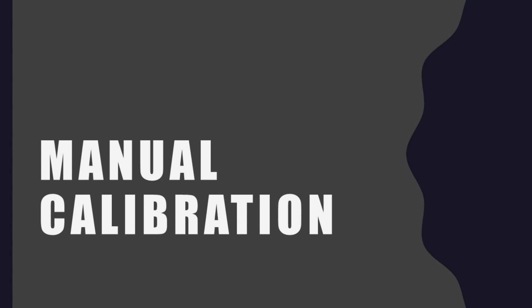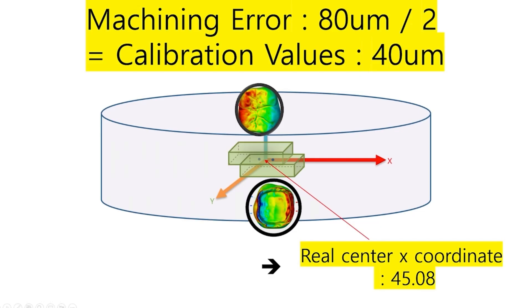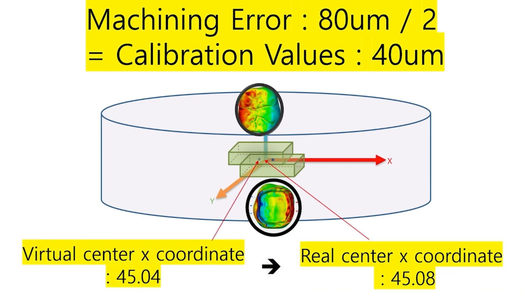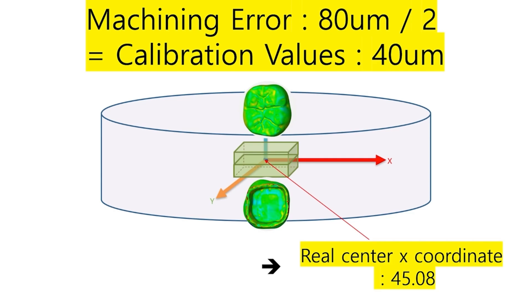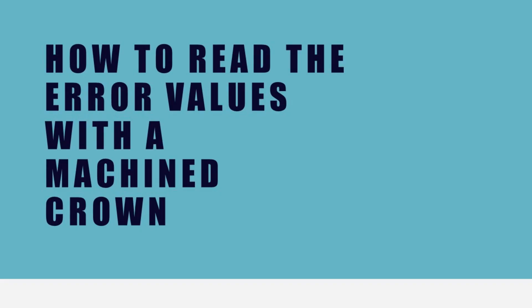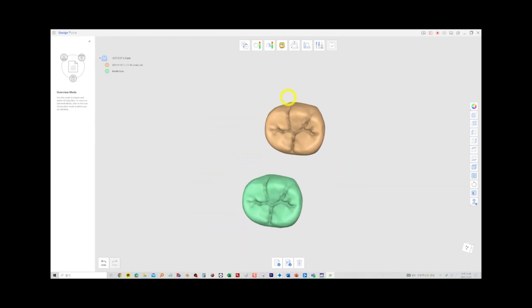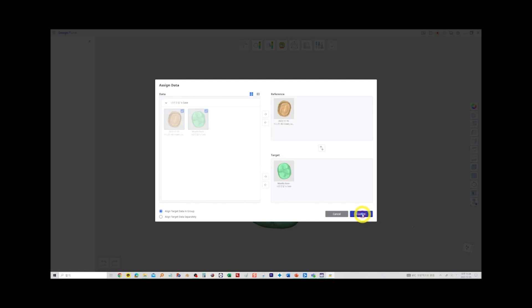There are two ways to fix off-center issues: one is manual, and the other is automatic. For the machine in the previous example, if the machining error is 80 micrometers in the x-axis direction, the coordinates are off by half of this value at 40 micrometers. Entering this value as a correction into the machine's software will correct it. In the previous method of checking for machining errors, we used auto-align to scan the machined crown and align it with the design file.